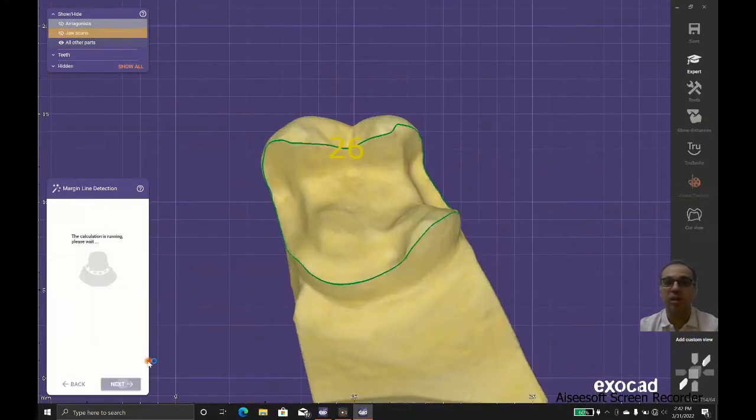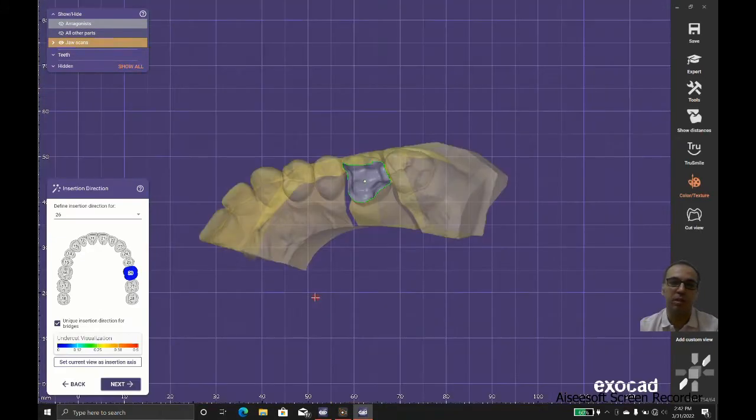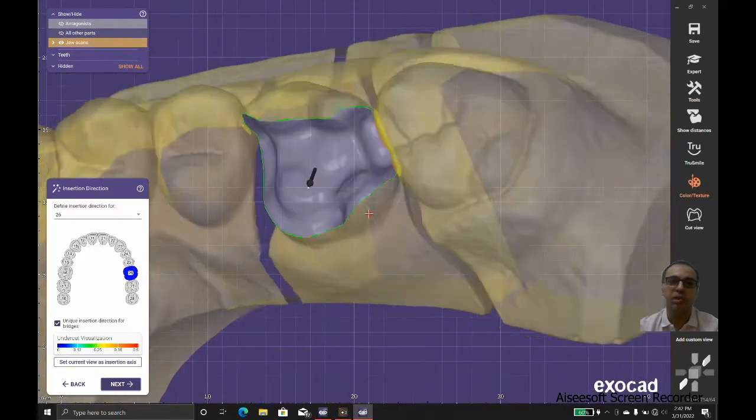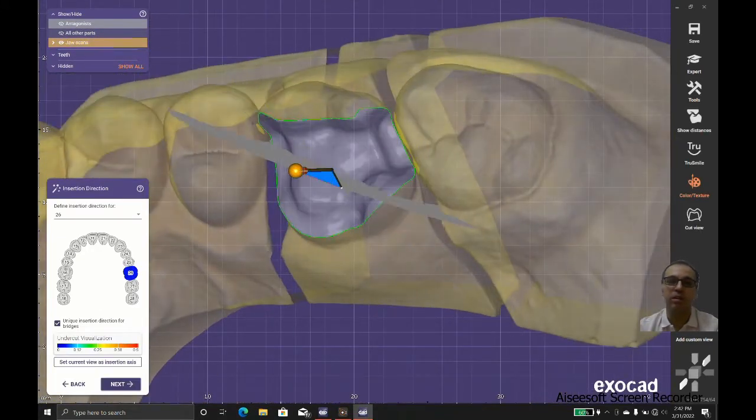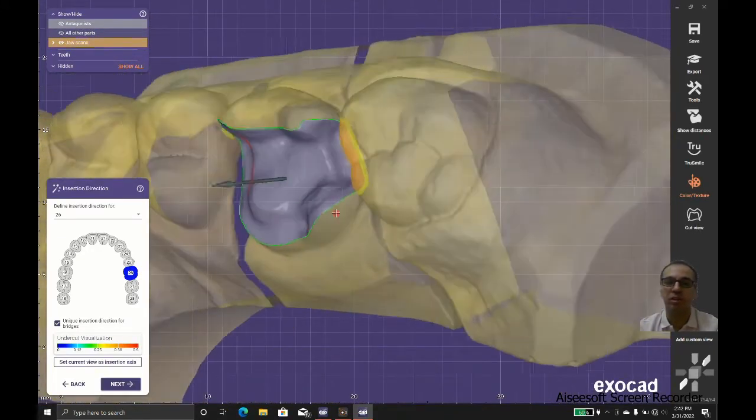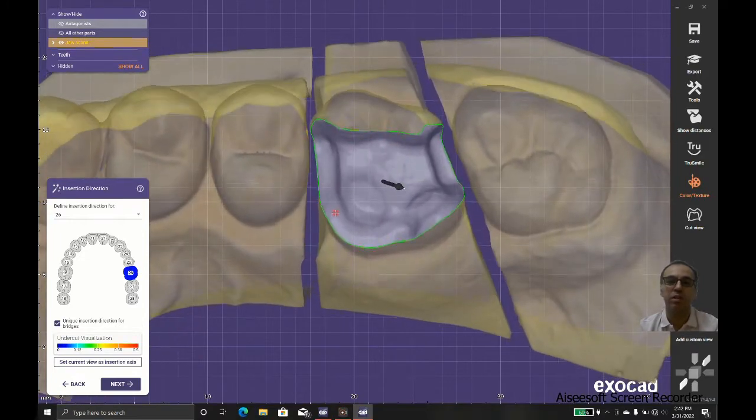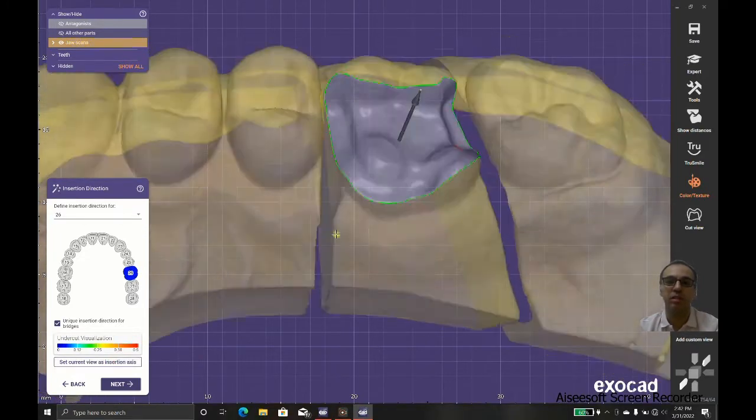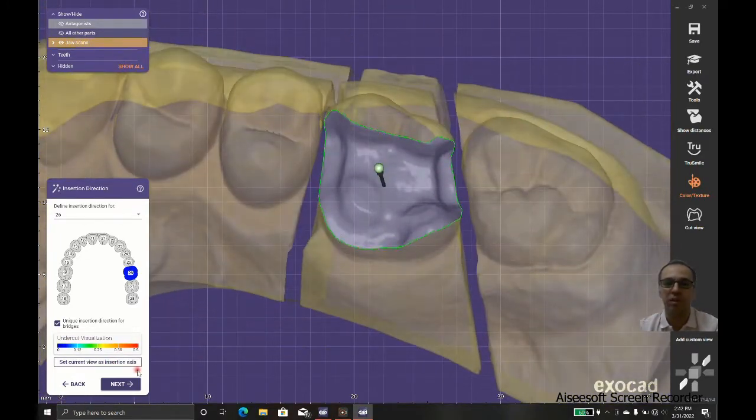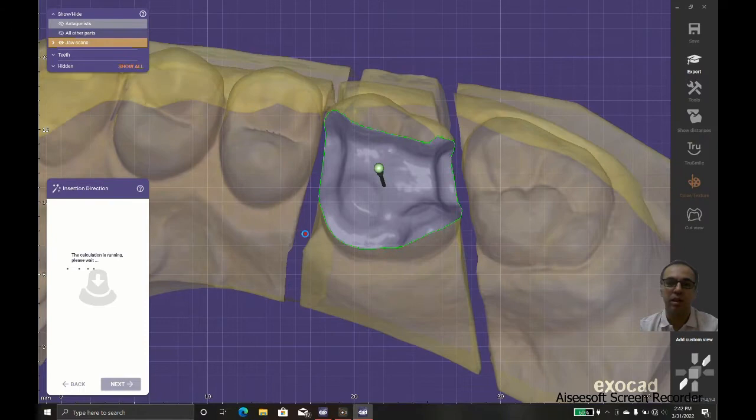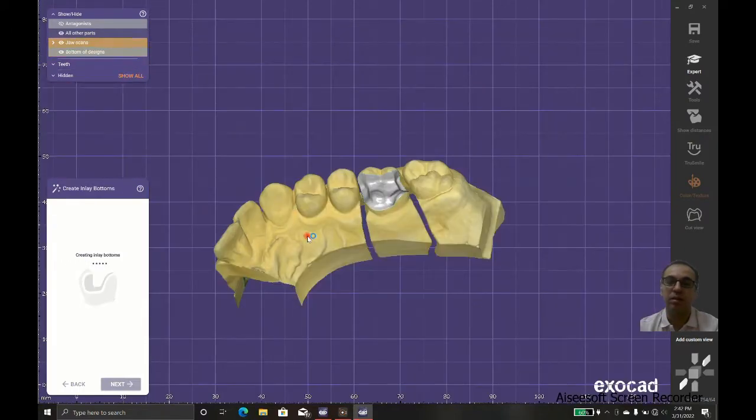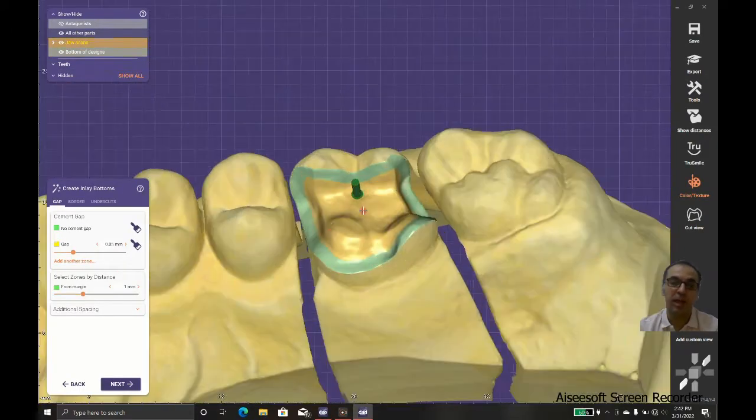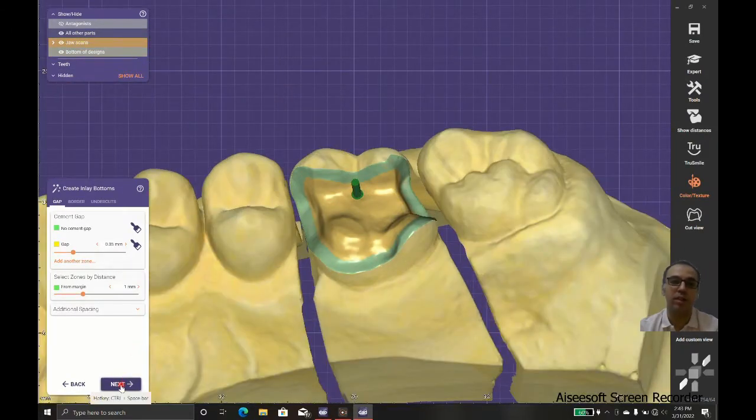We should have a good insertion direction because we shouldn't interfere with the neighboring teeth and we shouldn't have too much undercut with that kind of insertion direction.